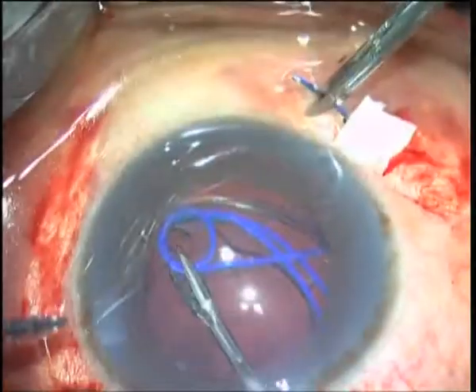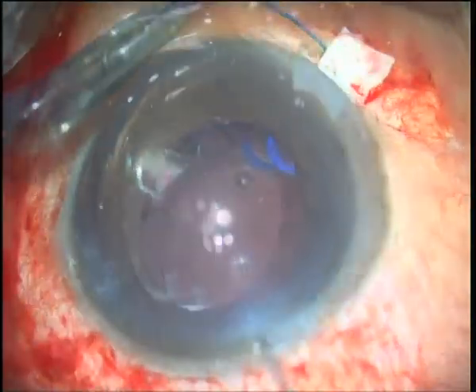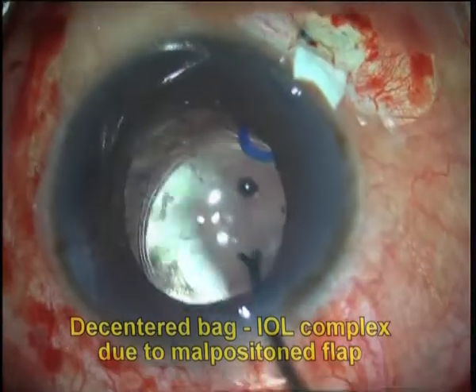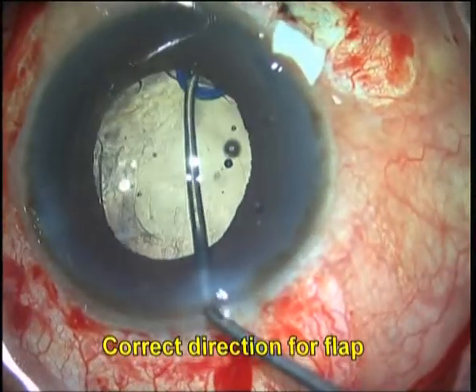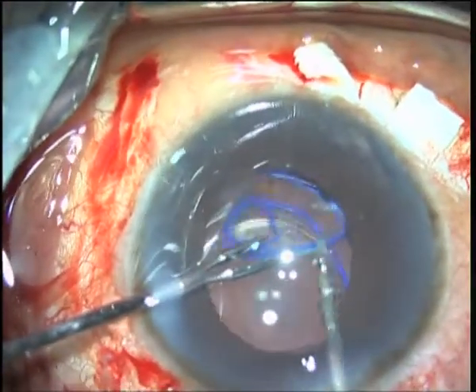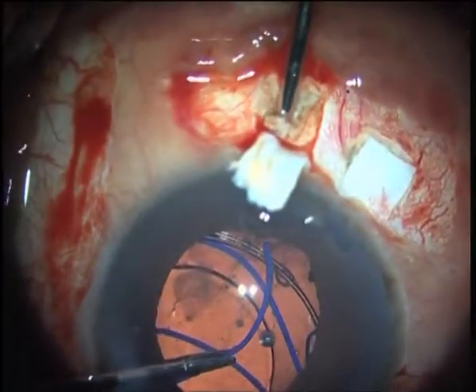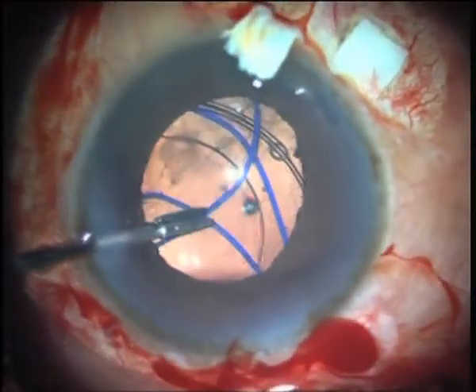Just as in scleral fixation via sutures, accurate placement of the flap is important to avoid decentration of the bag IOL complex. Even in case of a malpositioned flap, we found it easy to just create a new flap, interiorize, and then re-exteriorize the haptic of the device through the new, correctly positioned sclerotomy.